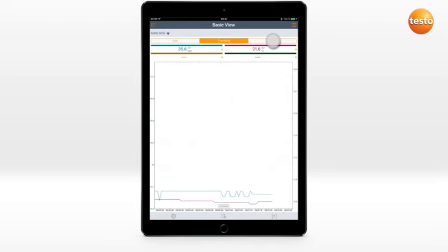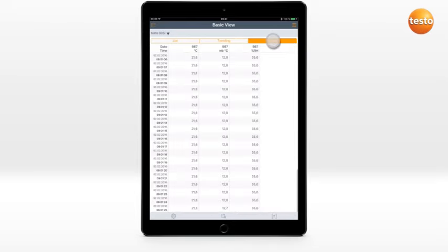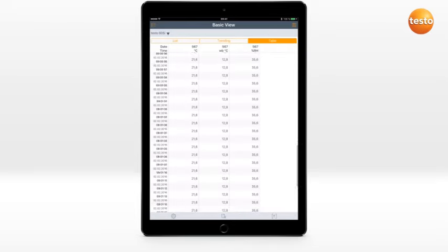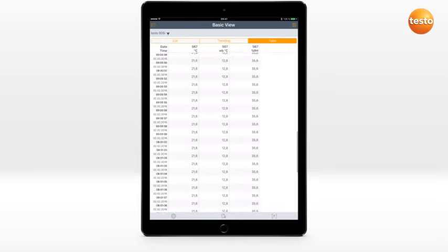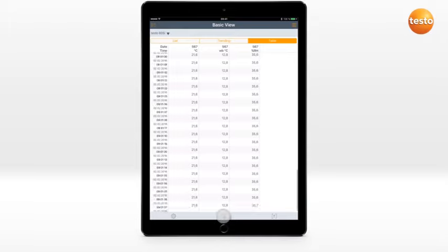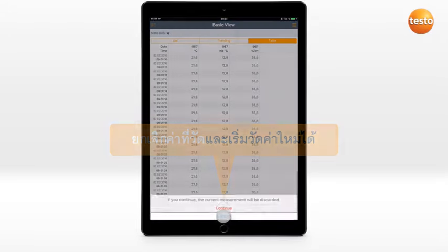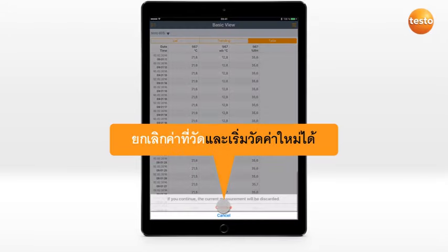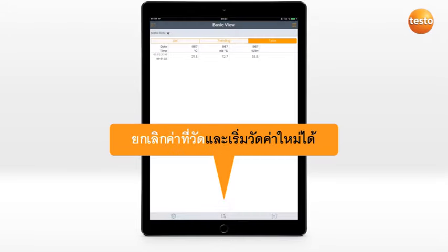The tabular view shows the measurement values for each measurement interval consecutively. The measurement can be cancelled and restarted.